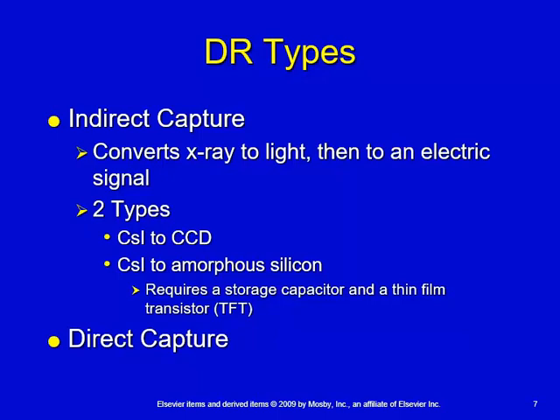And each one of these kind of behaves at some level like a solar panel. How a solar panel works is light hits the solar panel, it's energized to release electrons, and the electrons become your electricity. Instead of just being electricity in this case, we're quantizing how many electrons are captured, how many electrons are released and conducted, so that we can determine the signal strength, that signal being the X-rays incident on the image receptor.